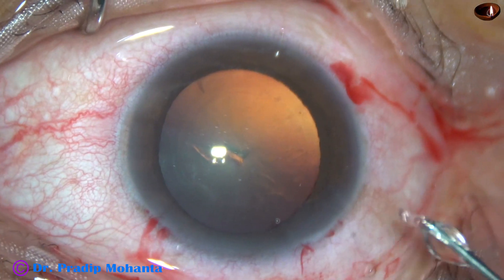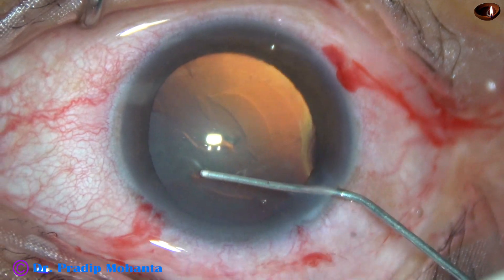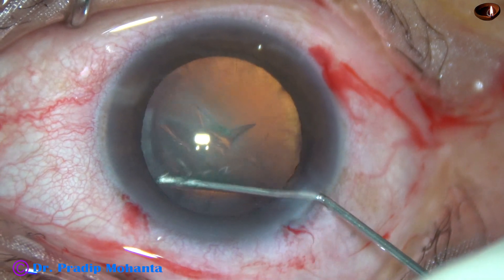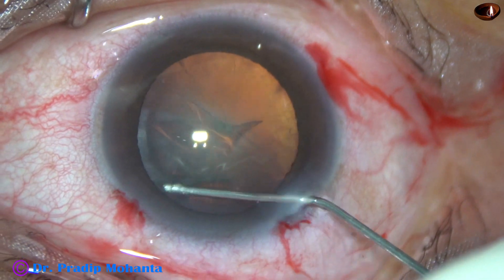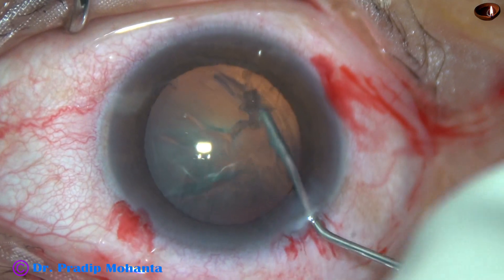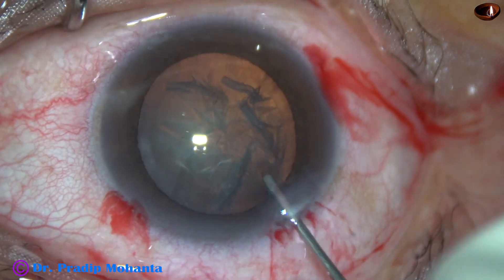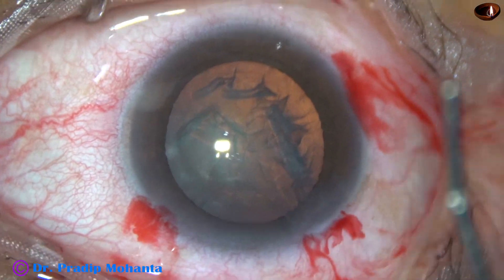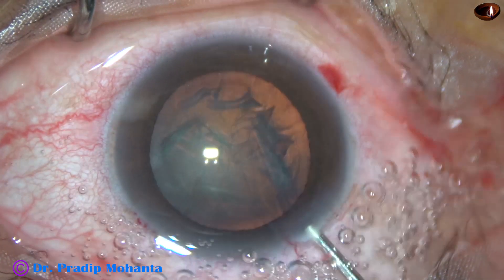I made all the steps on the posterior aspect of the limbus, on the scleral side, so that sealing of these wounds becomes easy. Now hydrodissection and nuclear rotation was as usual.